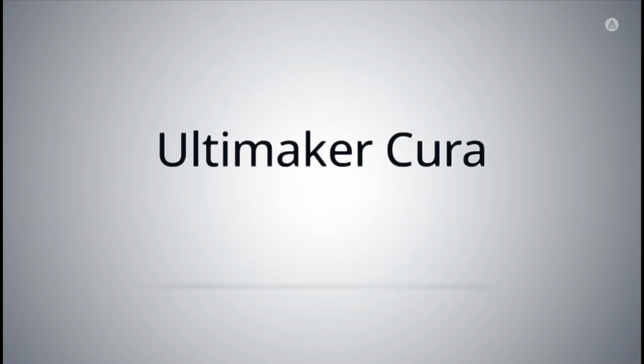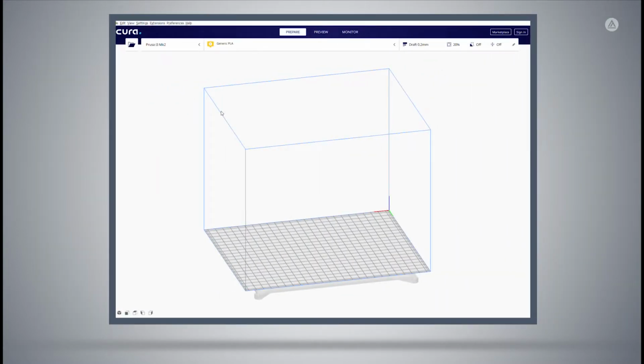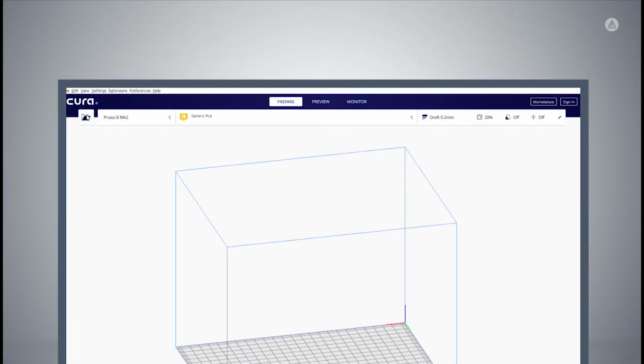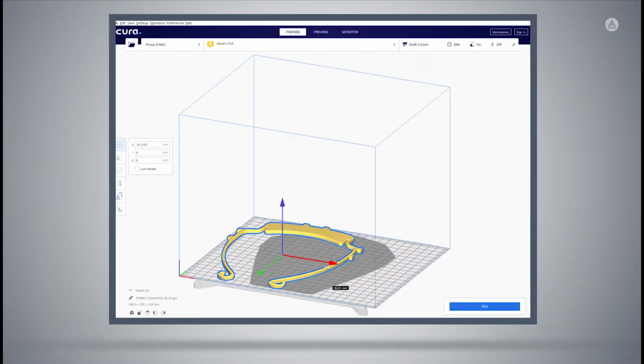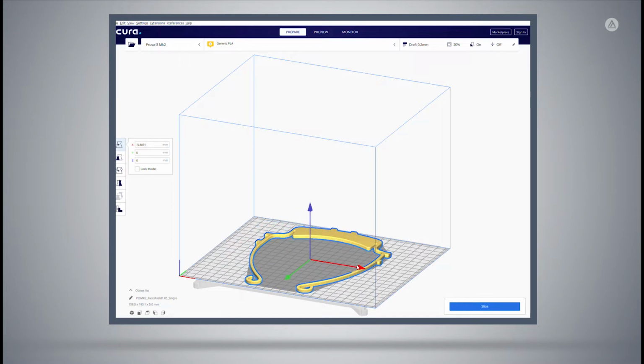We're going to use Ultimaker Cura to prepare these files. Any slicer will do, but this one is free and easy to use. When we open Cura, we first want to make sure that our printer is selected by navigating to the top left corner. In our lab, we use the Prusa i3, but any printer is fine as long as it has at least 160mm by 195mm build footprint. Go ahead and open the file by clicking on the folder icon at the top left corner. Make sure that it's centered on your build plate by first selecting the object, then using the move and rotation tools to make sure it fits.